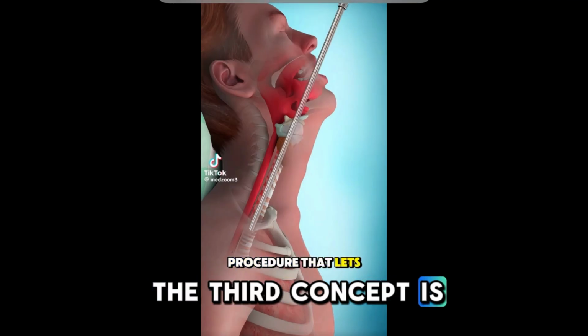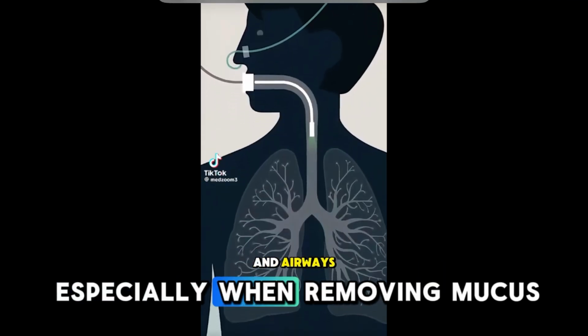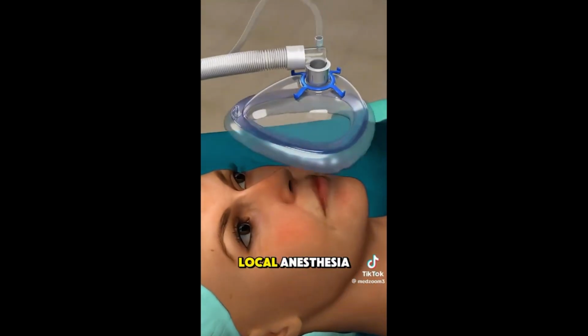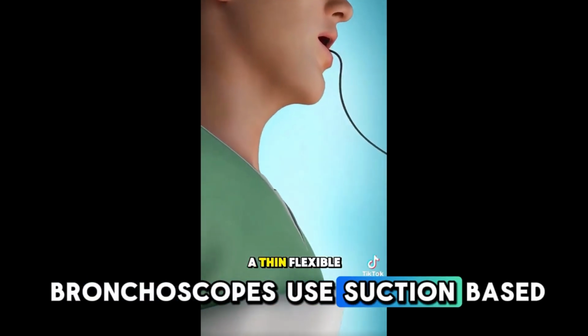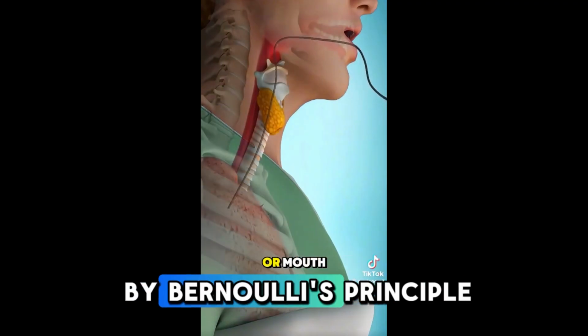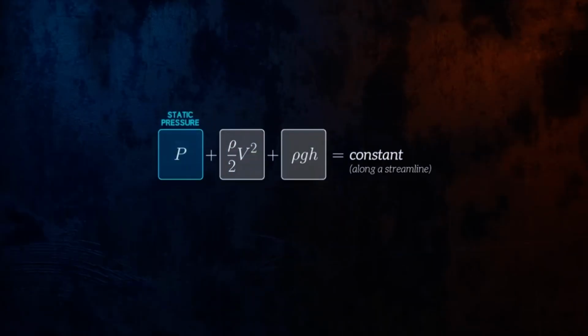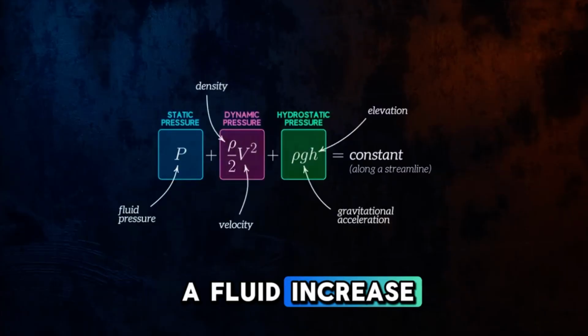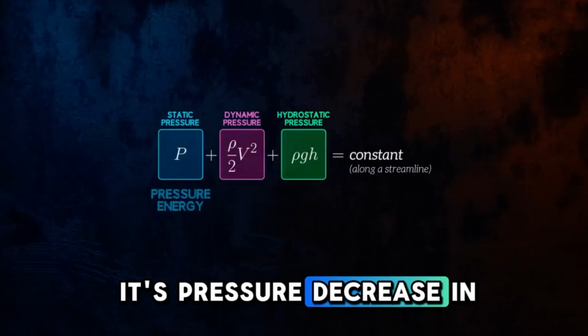The third concept is fluid dynamics, especially when removing mucus or other fluids from the lungs. Bronchoscopes use suction based on pressure differences, which can be explained by Bernoulli's principle. This equation shows that when the velocity of a fluid increases, its pressure decreases.